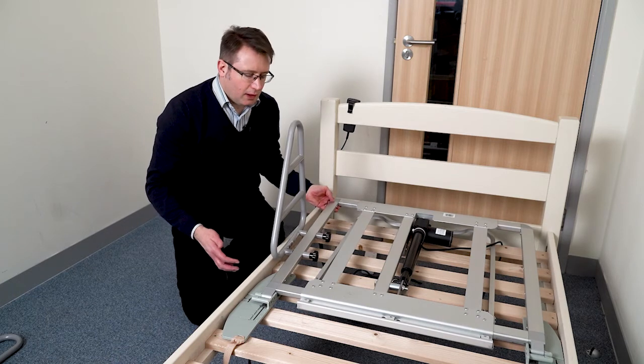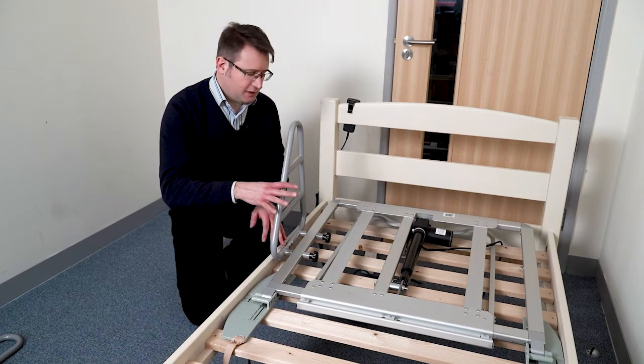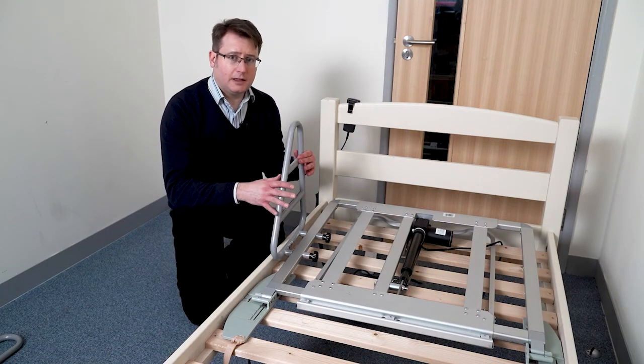It might be worth noting that the thicker a client's mattress, the less rail they are likely to see.